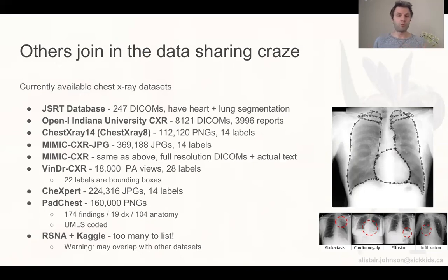It's a very standard format in medical imaging, but there are some interesting aspects of that high resolution. For example, DICOMs are actually 16-bit, which is higher bit depth than you can see with your human eye. So when they're visualizing a DICOM, they actually truncate the resolution. It's in a process called windowing, so you can actually visualize what's going on with your eyes.